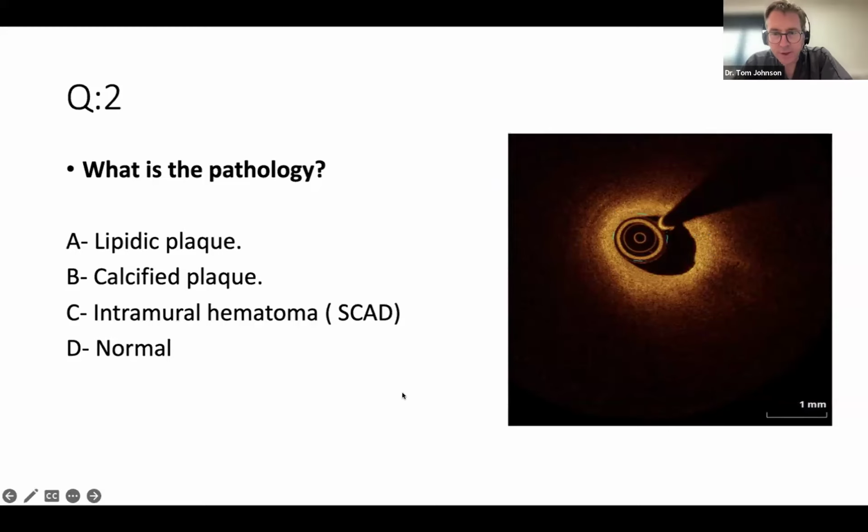Yeah, so the only other thing to signal is that you can, again, try to look for normal structures. One of the criticisms of OCT against IVUS is that in this setting you have highly attenuating tissue, so you can't see beyond the structure, the lipid absorbing all of the light, and we can't actually make out the vessel margin. But again, it's always worth trying to seek out some normal structures, and you can actually see the medial band extending probably from about 7 or 8 o'clock around to about 10 o'clock.